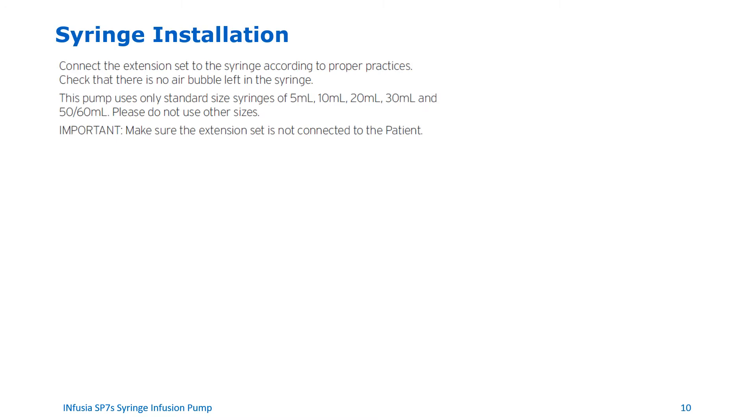How to install the syringe. Make sure to connect the extension set to the syringe according to your clinical practices. Make sure that there is no air bubble in the syringe. Please note that you can only use the following standard size syringes on this device: 5 ml, 10 ml, 20 ml, 30 ml, and 50-60 ml. The pump does not recognize other syringe sizes.